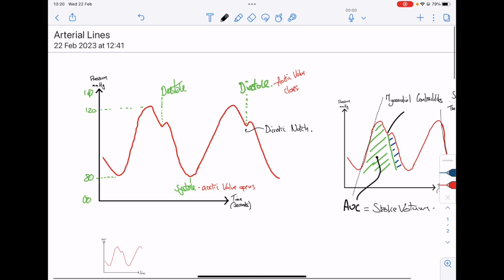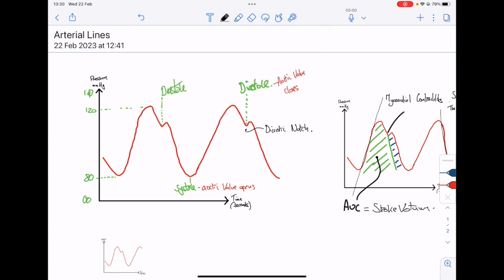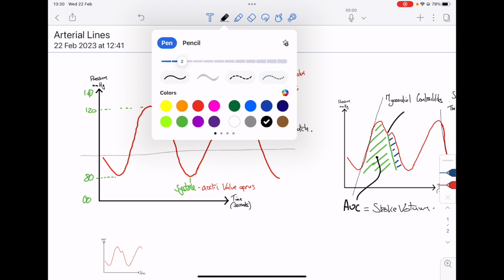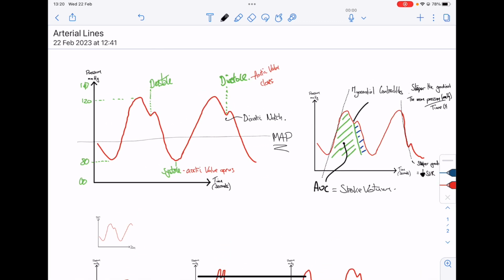And there's also perhaps a wiggly line that needs to go somewhere across this whole shebang, although it is not accurate. I'm going to do it there, and that would be your mean arterial pressure, which is the one that we actually really care about, if we're all being honest. Okay, sounds reasonable. That would probably get you making some pretty good forward progress in an exam situation.